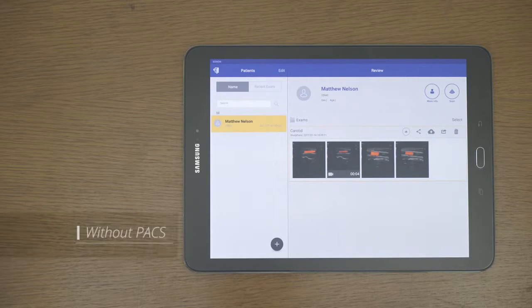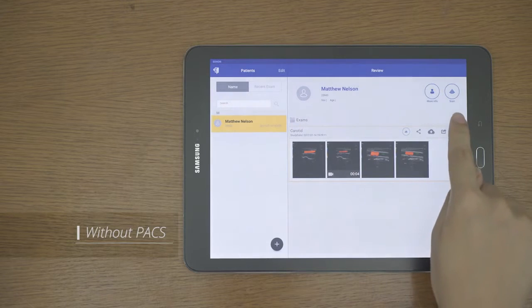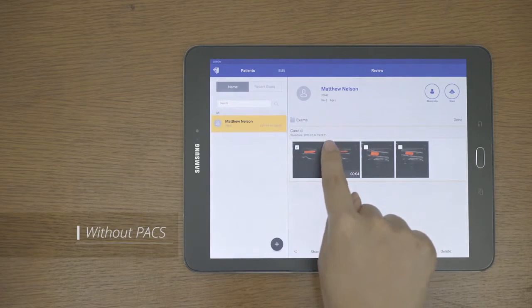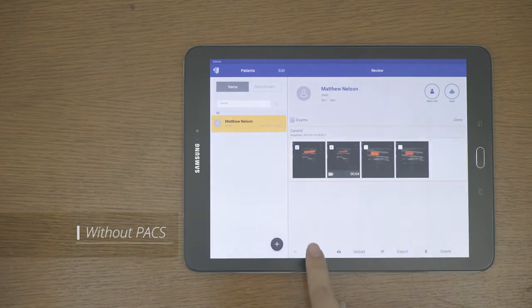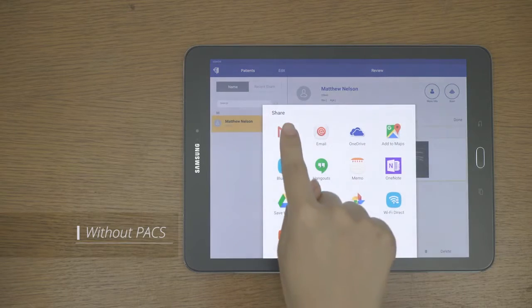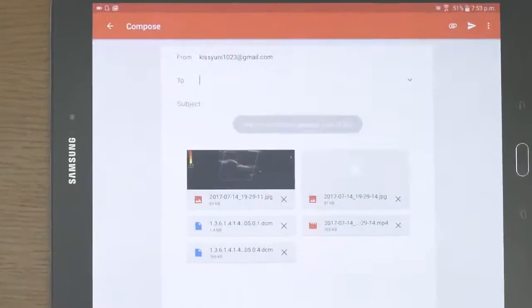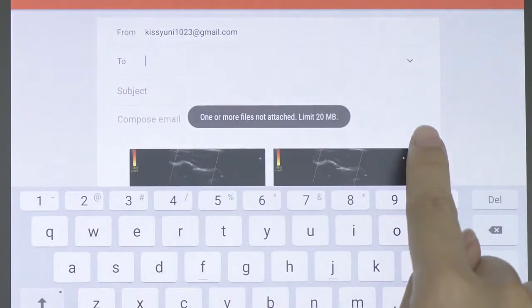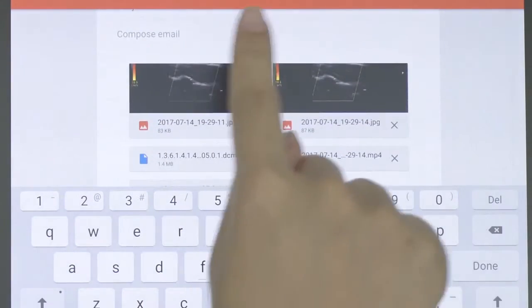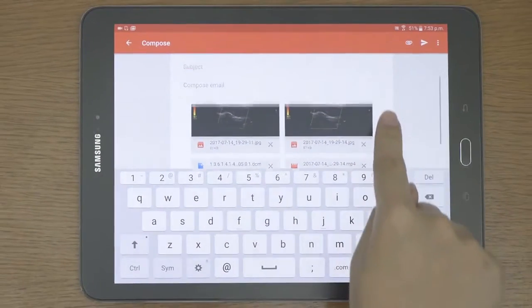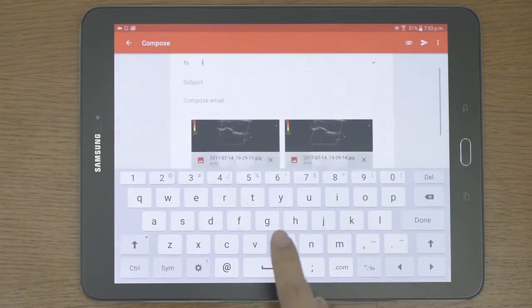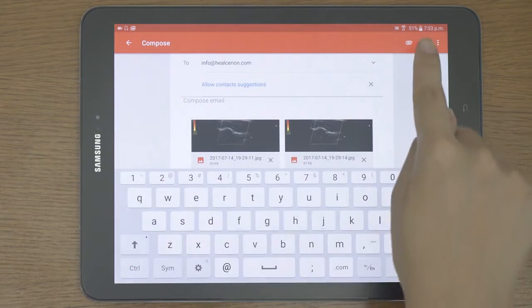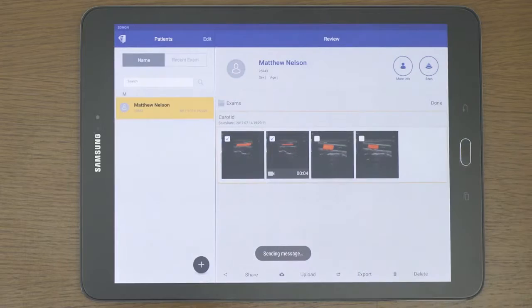If you do not have PACS, you can transfer using the share feature. Select the image you want, tap the share button to see a variety of apps that share images within your mobile device. When using email, please remember that the size of the attached image can be limited by the type of the email. For example, Gmail only allows up to 20 megabytes of each image to be attached onto each email.